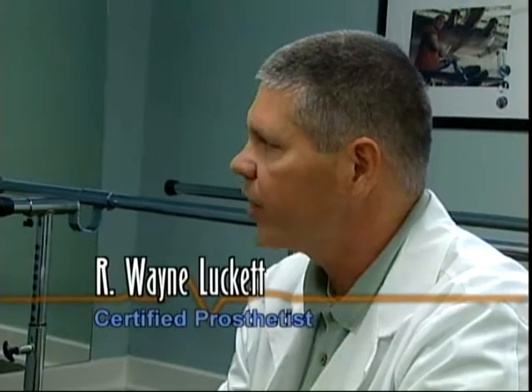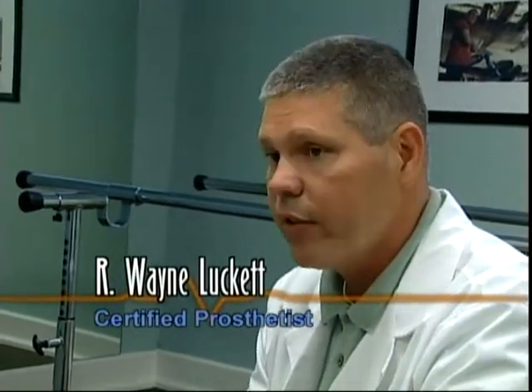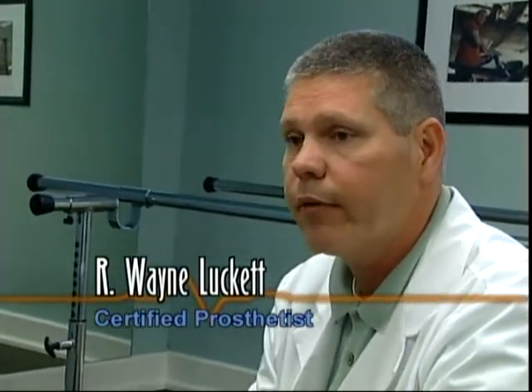Now, is this something that will have to be done in another few months as well because of the leg, or because it's going to be weight bearing now, it'll not atrophy as quickly? The vacuum system will help to reduce the amount. It will help to control the volume of his leg a little bit. He's probably still got some healing that's going to continue to occur, and we may be looking at another socket 6 to 9 months from now. At that point, he should be pretty stabilized to the point where he'll have a device that should last somewhere in the 3 to 5 year range.